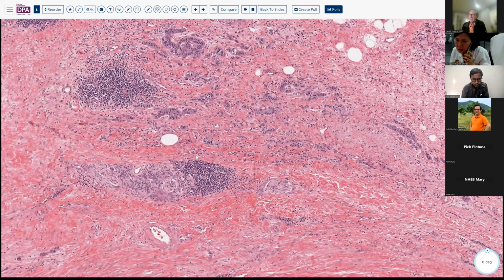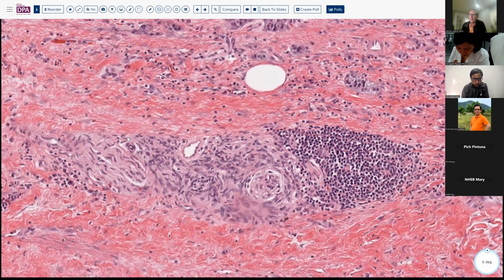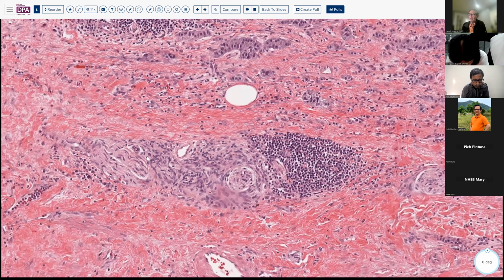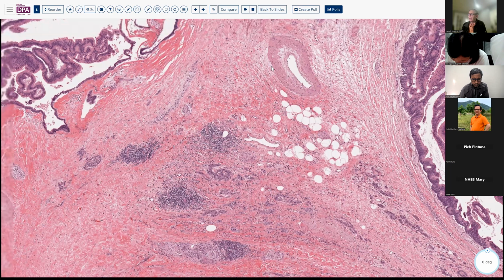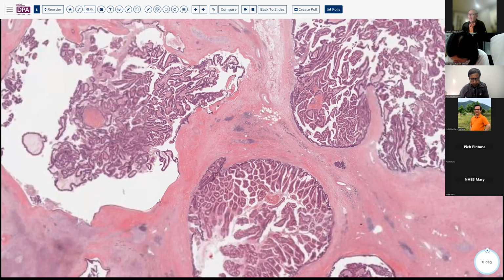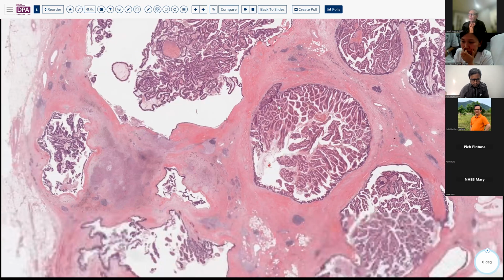But looking to see if you have perineural invasion, you'd want to ask, is this perineural invasion here? Or do we have other kinds of tumor that is present immediately adjacent to large vessels in an area such as this, where there shouldn't be normal acinar tissue? Those are the clues that we use in a setting like this to determine whether we have invasive neoplasia.